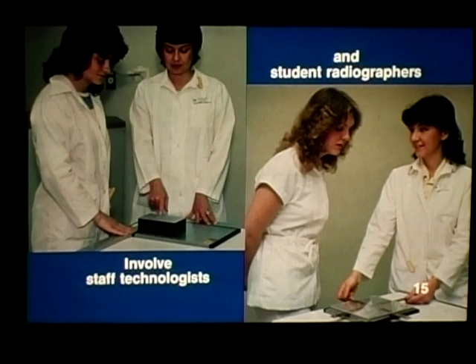If the department has a teaching program, the student should be encouraged to participate in quality assurance testing. Quality assurance test devices are excellent tools for teaching students some of the basic operating concepts of X-ray equipment. Number 16. Darkroom personnel can play an active role in processor monitoring. If properly trained, darkroom technicians can expose and process sensitometric strips, periodically test for safe light fog, check replenishment levels, and monitor processor temperatures. Such duties will add to their feelings of importance and responsibility in the department.